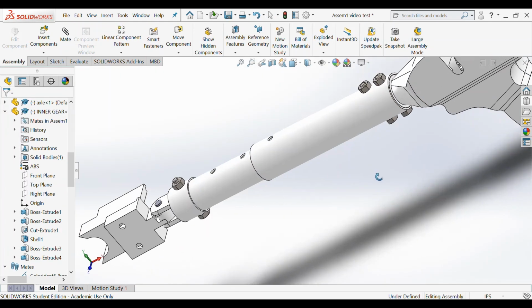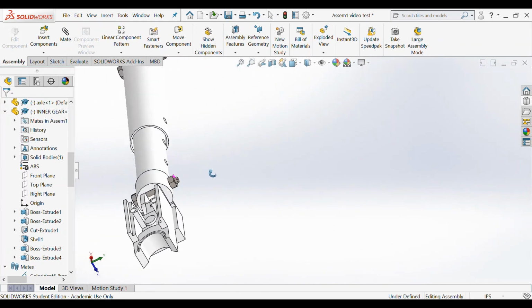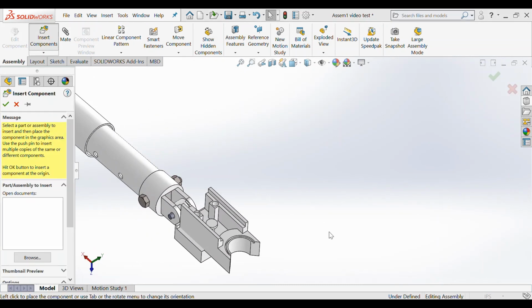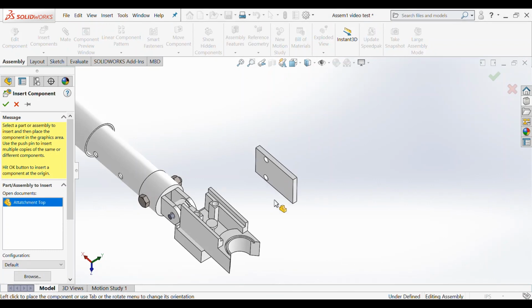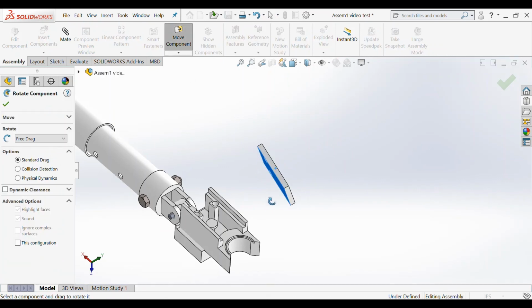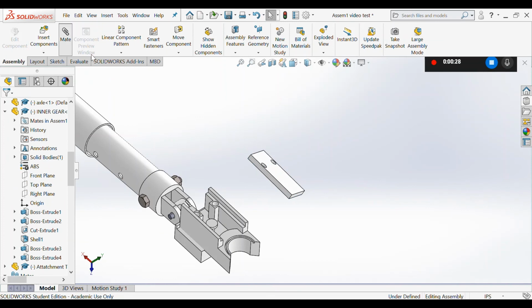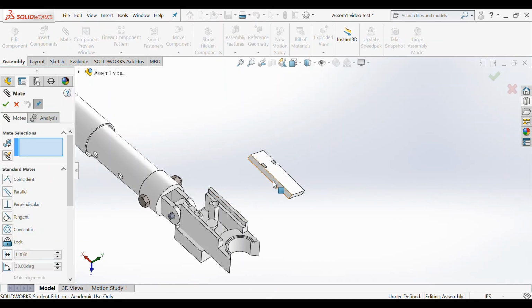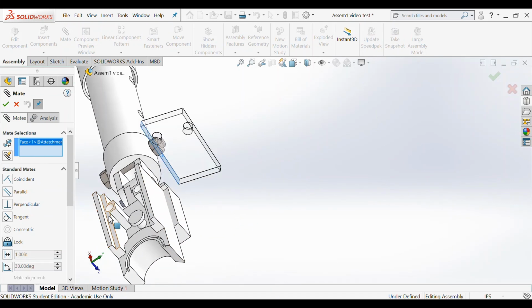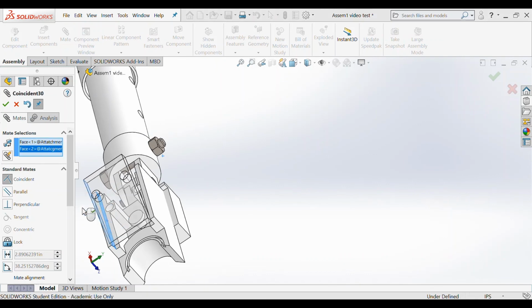Last but not least, I'm going to go ahead and insert the attachment piece top. So I'm going to go up to Insert Components. I'm going to click the piece in. Next, I'm going to go ahead and rotate my component so that it is aligned how I'd like to place it on the attachment piece. Next, I'm going to go ahead and mate this side of the attachment piece top to the inner face of the attachment piece. And I'm going to make them coincident.